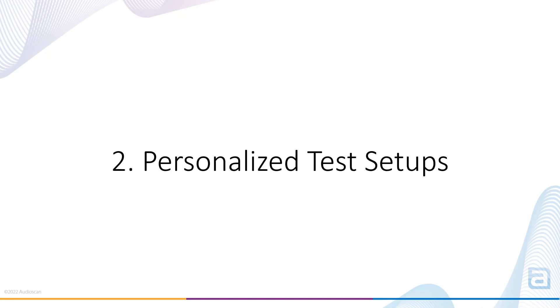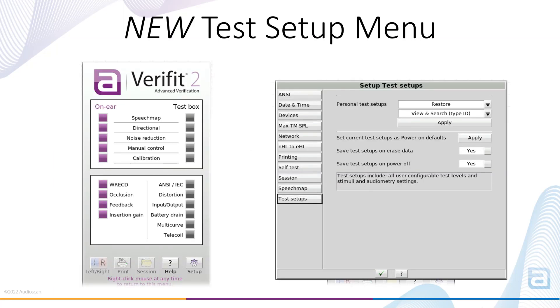Personalized Test Setups. This feature enables you to store different verification protocols. It may be that you have an adult and pediatric protocol you need to switch between, a protocol where frequency-lowering verification is performed, or any other protocol you may use in your clinic. To access personalized test setups, select Setup from the Verifit 2 main menu and then select Test Setups.